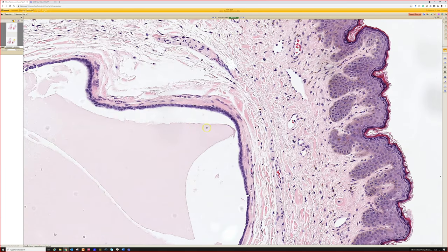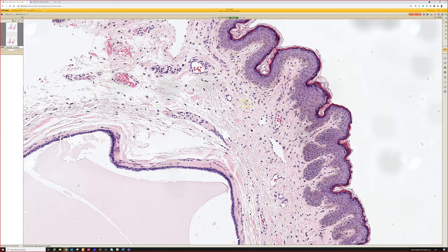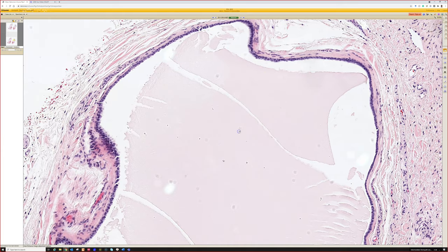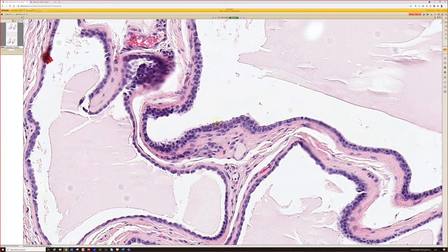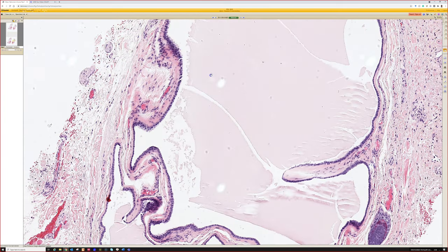And I'm like, aha, we're at the top of a Hidrocystoma. So always think of that if you've got a little papule near the eyelid and you don't really see any good reason for it on your shave biopsy, cut some deeper levels and look carefully at the very bottom of the shave. And sometimes you'll see the top of the Hidrocystoma. Here we actually see the sweat secretion. This basically looks like a sweat duct that's just massively dilated, okay? And has a thin layer of cuboidal lining, sometimes flat and sometimes with apocrine snout. So if you really want to say apocrine Hidrocystoma or eccrine, cool, go for it. But I just say Hidrocystoma.